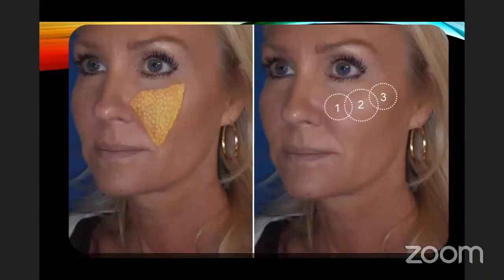A large part of the cheek volume is the malar fat pad, and the malar fat pad sits in the mid-cheek. It lies against the nasolabial fold, and the apex is at the zygomatic region. And I like to break the cheek into really 3 aspects. Number 1, as you see, is the infraorbital. Number 2 is the malar, and number 3 is the zygomatic. So when I do implants or filler, those are the areas on which we concentrate.